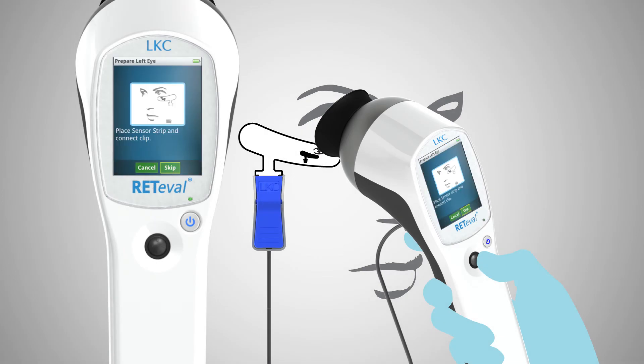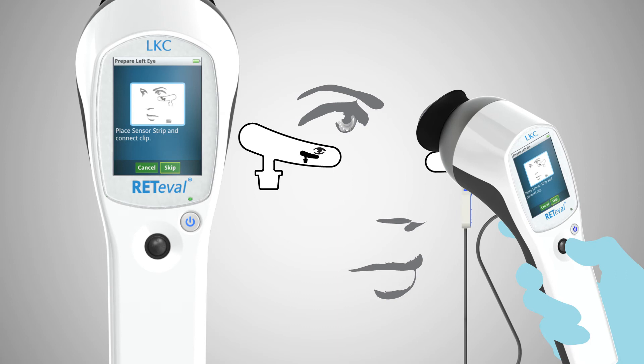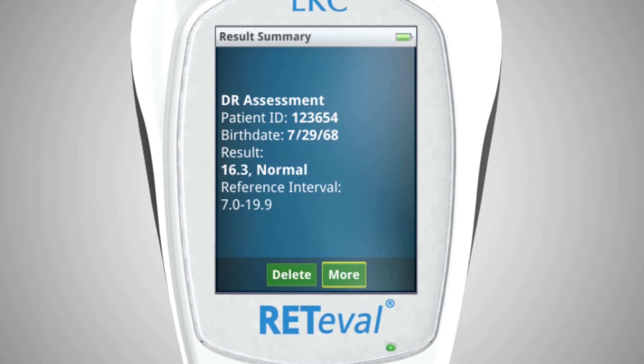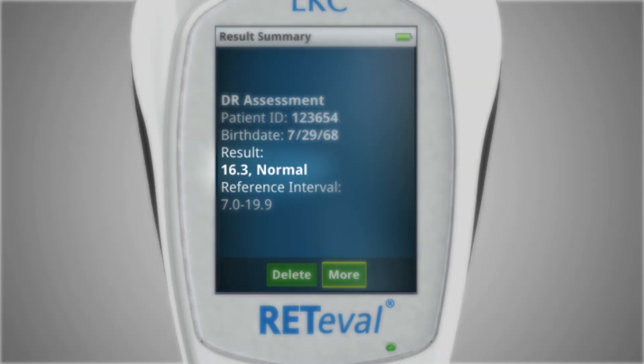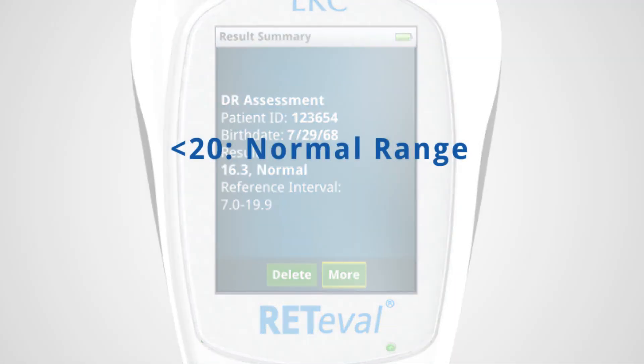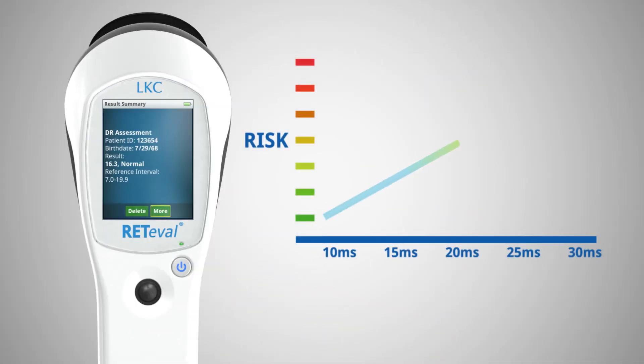Redaval will indicate when the test is completed. Repeat the procedure on the left eye. Results of the test are shown on the Redaval display. The test results will show a DR score to indicate whether the patient likely does not have vision threatening diabetic retinopathy. A score of less than 20 indicates the patient is within the normal range, while a score of 20 or above indicates increased risk of vision threatening diabetic retinopathy. The DR protocol offers accurate results that are easy to interpret with the score.